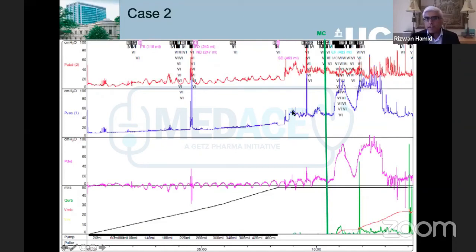Here, the patient was asked to stand up. You can argue that there's a little bit of activity here, but now the micturition command was given. And here's another fallacy. You can see this because we were moving the urinal, adjusting, so it has recorded a very high flow rate. And hence, please, please never, ever, I mean, there are no absolutes in medicine, but do not report the urodynamics from the computer-generated figures. That is completely wrong. Here, the computer will tell you there's a flow rate of about 120 mils per second, while we know that it is less than 5. And that is why it's a computer artifact.